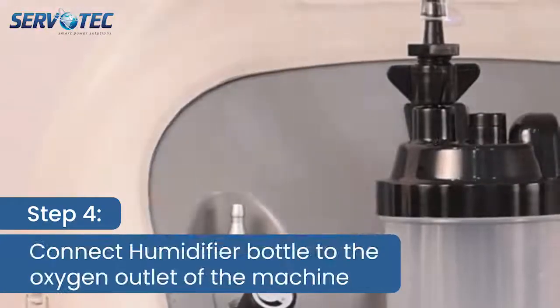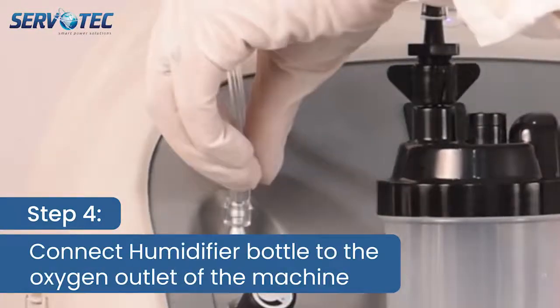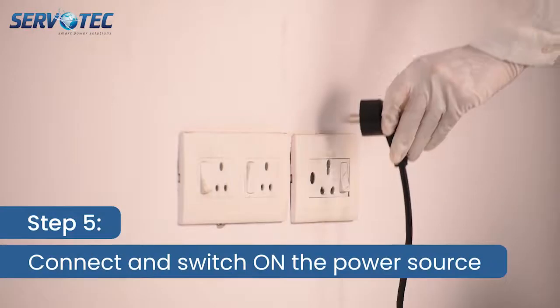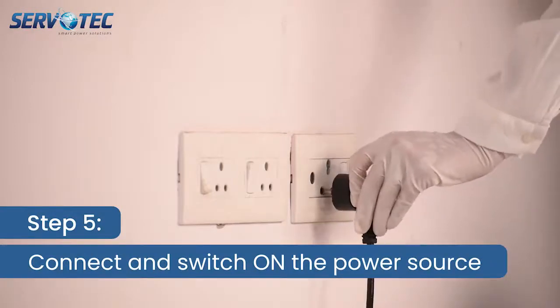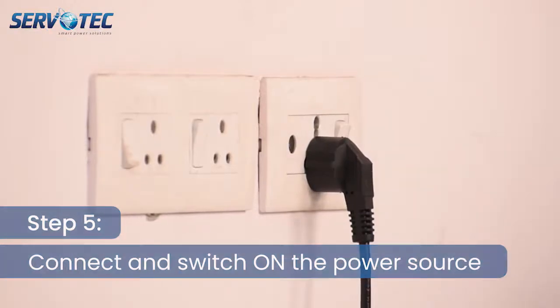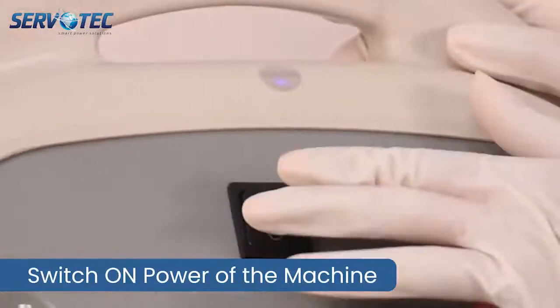Step 4. Connect humidifier bottle connecting pipe to the oxygen outlet of the machine as shown. Step 5. Now connect the power cord of the oxygen concentrator to the main supply plug of the power source and switch it on. Switch on the power button of the machine.